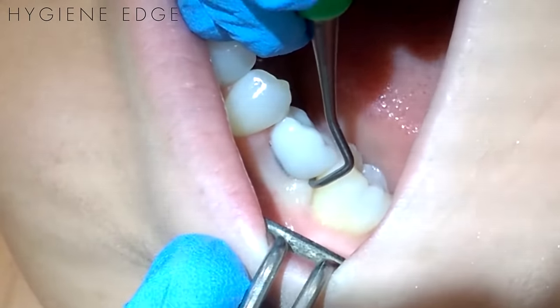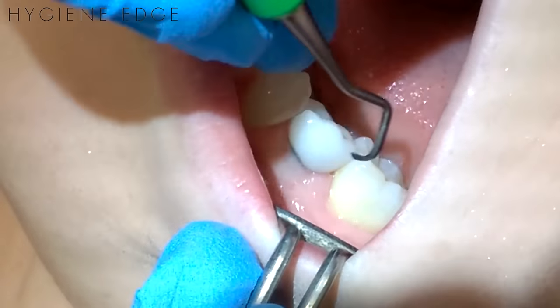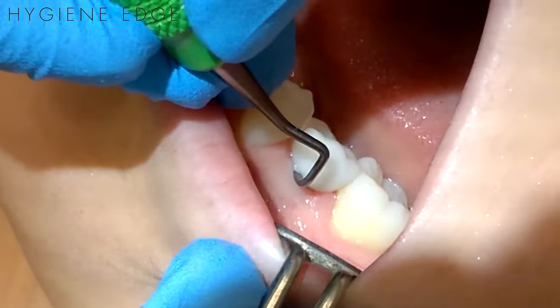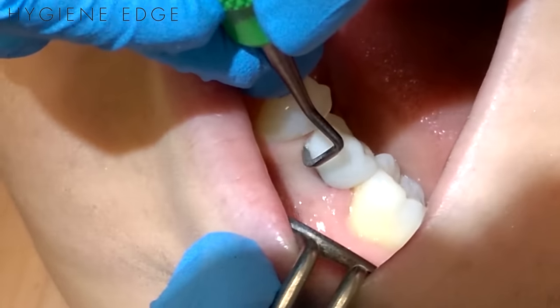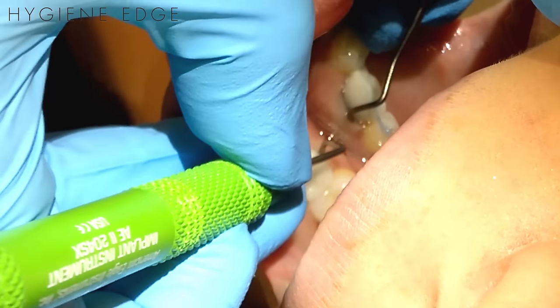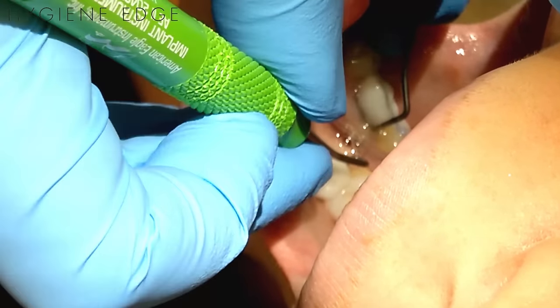It is made from a medical grade titanium, making it softer than the softest implant, which prevents scratching. In my practice, I have the American Eagle Implant Maintenance Kit, and it has four different instruments that cover all aspects and angulations needed to maintain implants in all areas of the mouth.